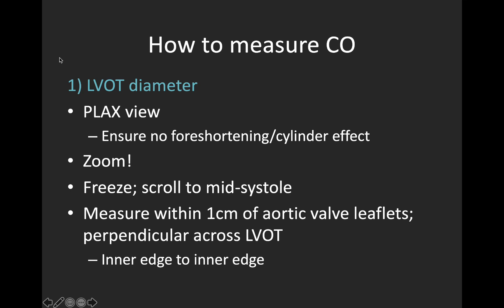So we need two pieces of information: the LVOT radius — or diameter divided by two — and the LVOT VTI. To get your LVOT radius, we'll measure the diameter and then halve it. We're going to use a parasternal long axis view, and it's really important to ensure there's no foreshortening or cylinder effect. You need to zoom, because this has to be a very precise measure — there are a lot of potential sources of error, so it's super important to do everything we can to get the most precise measurement possible.